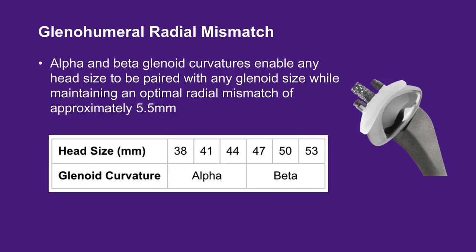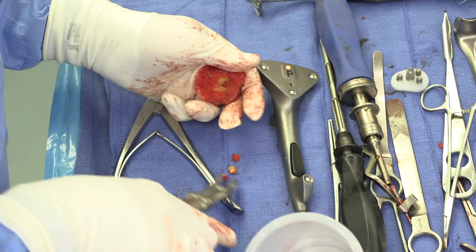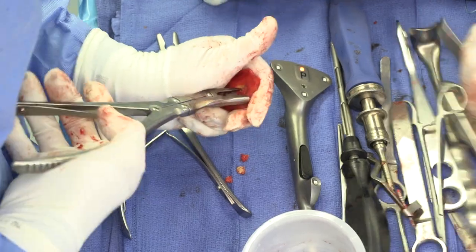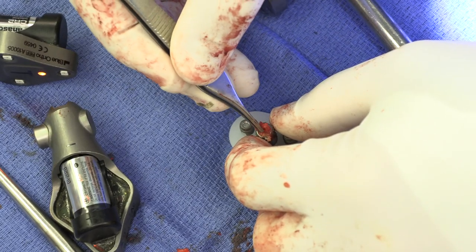Since there is a mismatch between the glenoid and humeral head components — referred to as the radial mismatch — the glenoid components are provided with two available articular curvatures named alpha and beta, so that these glenoid components can be matched with any size humeral head component ranging from 38 to 53 millimeters, while obtaining an optimal radial mismatch of 5.5 millimeters. In this case, an alpha-curvature glenoid was selected based upon the size of the removed humeral head. Cancellous bone from the humeral head is used to fill the bone cage.